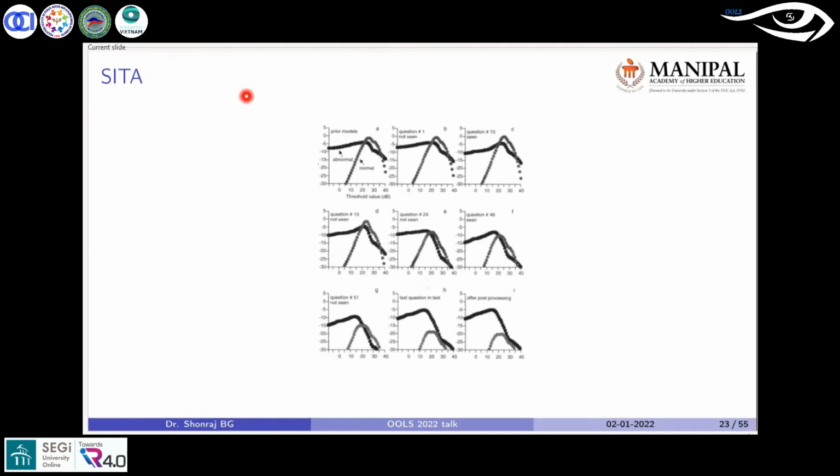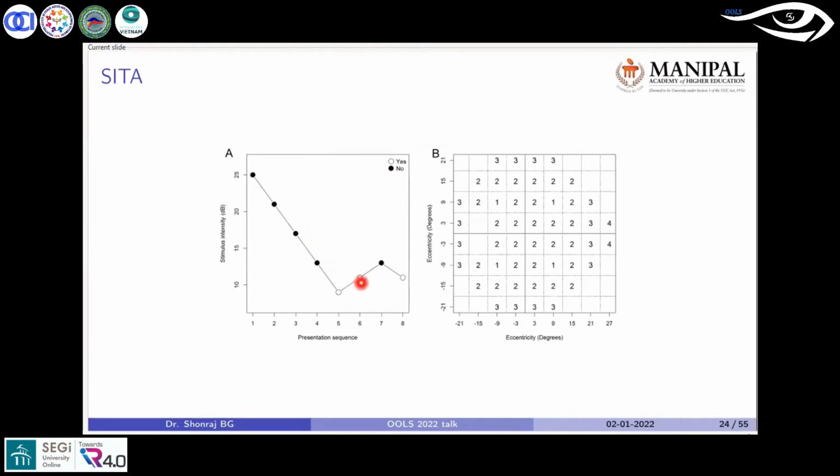We think it starts with a prior probability mass function, much like your ZEST test procedure, but the step sizes follow what is seen in the staircases.